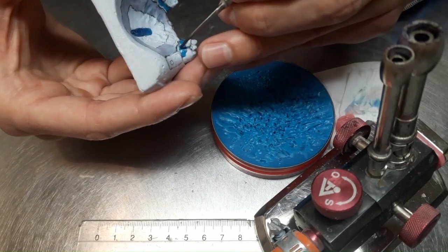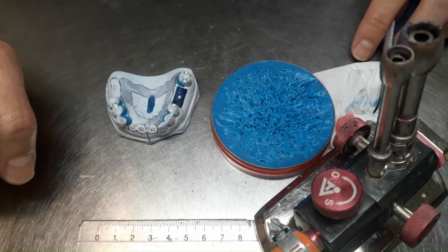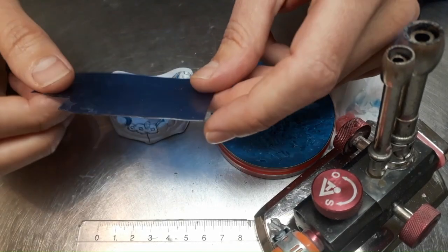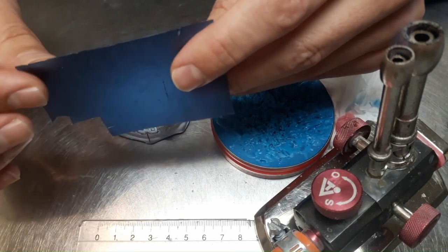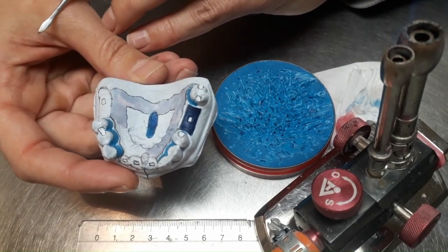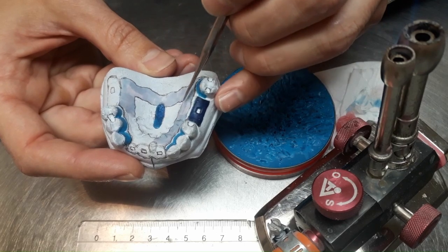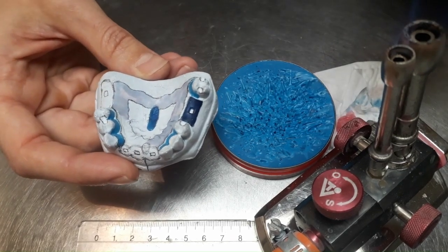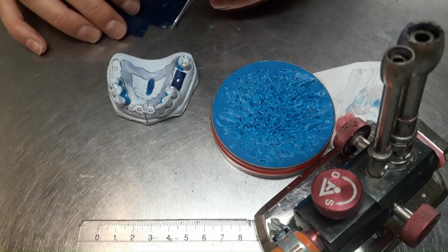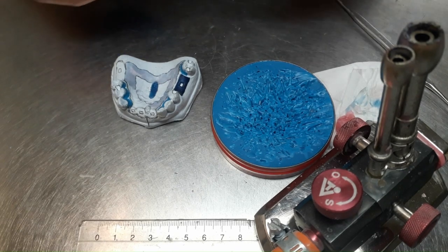Because if you do it like this, you risk to overdo it, right? And to create more space than you really need, which will diminish the space for the tongue and impair the speech maybe. So now we place foils, wax foils, foliating the model. So this is wax foil, 0.4 millimeters. It's calibrated. So we already did here on the middle of the palate, the torus. Here you see the main connector, but nevertheless I wanted to have it under my control. You see that the connector does not touch there, but still the technician placed this wax just to make sure that whatever happens, it's safe.